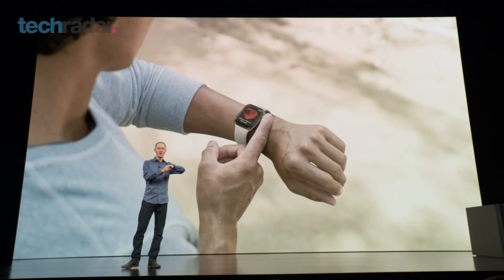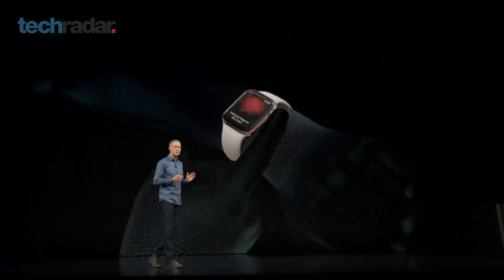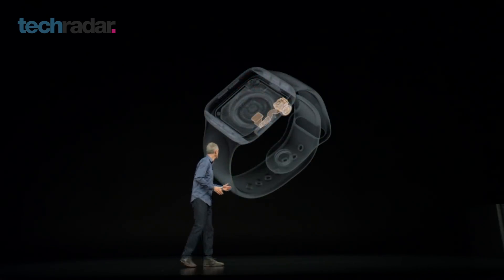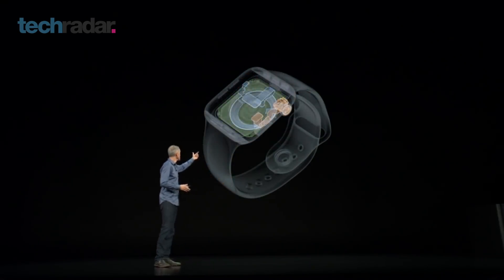While the design looks great, the real focus from Apple seems to be on health. They got a cardiologist on stage to talk about the fact that the digital crown and the back of the watch have electrodes, so you can take an ECG — the first device you can buy over the counter that can do that.